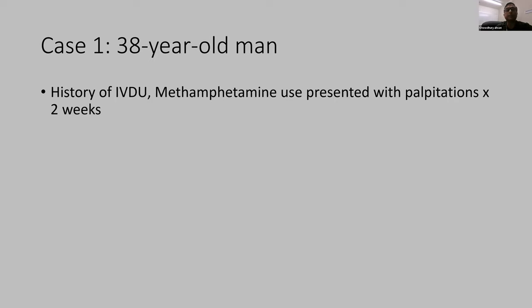Rafique Bhai, unmute. When a pacemaker reaches elective replacement, you still have at least 3 months left of battery, right? Full function battery. Even after that, there is life left in the pacemaker. So a pacemaker reaching ERI doesn't mean that the patient has to be admitted to the hospital. Correct. So that was a comment, but before I bombard you with this one, this is ugly. So this is ugly, but let me give you the history.